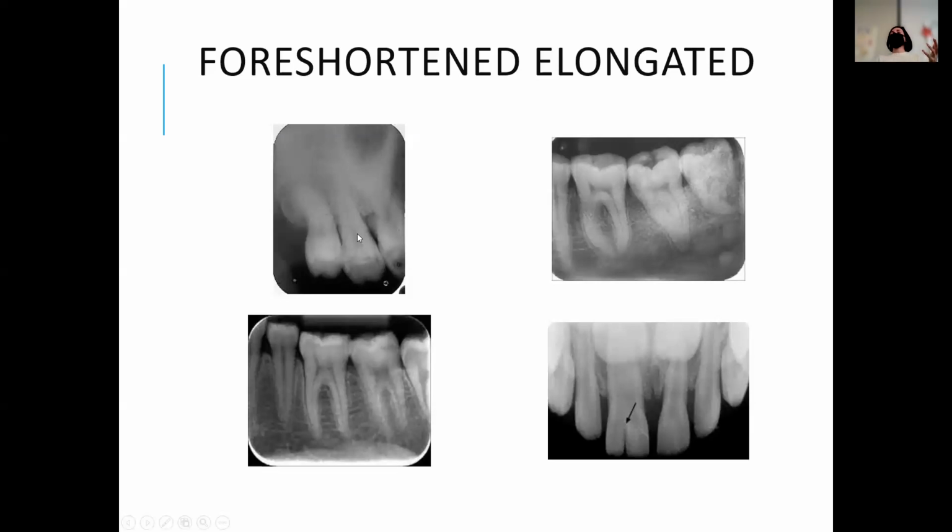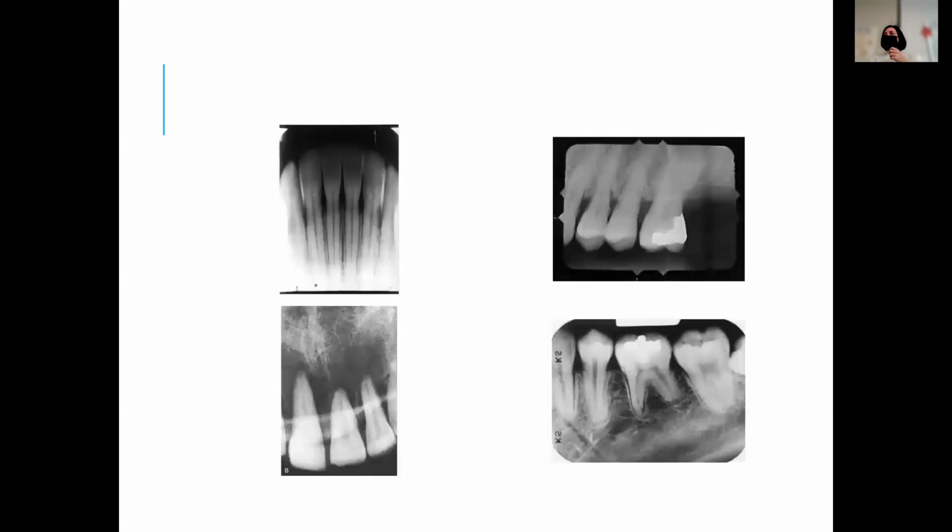You should look for seeing more of the occlusal surface and kind of a stunted root, or just this stretched out appearance, where it looks kind of long. And sometimes things will get distorted. Like look at the crown of the tooth, look at the incisal edges, because all of this looks pretty realistic to what I would expect a tooth to look like. But these all look kind of stretched, the whole crown portion and incisal edge, it all just looks long and stretched out.